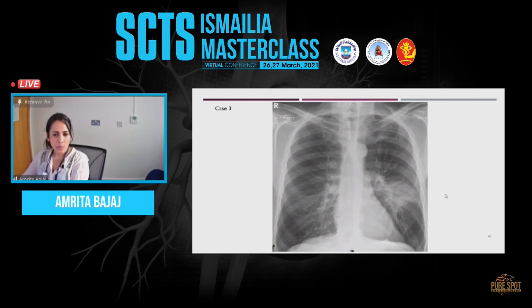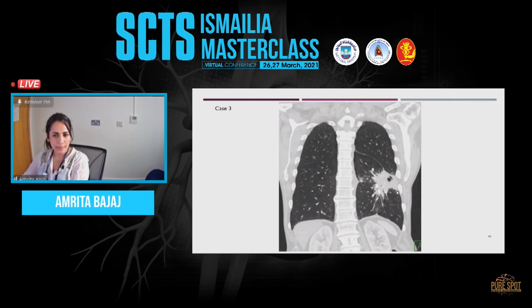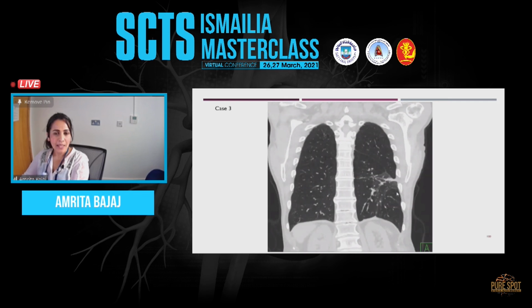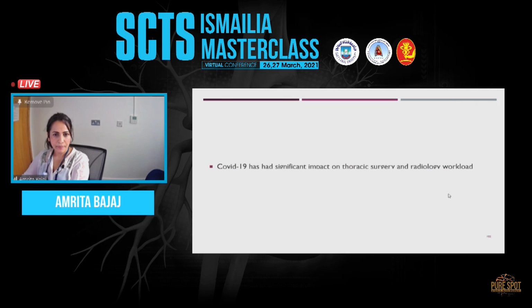A third case, where you can see a large mass on CT. It's large, it's cavitating, it's spiculated, all the signs, and it was PET avid. On a subsequent pre-operative CT, and we have a guideline here where anything outside a 6-week window prior to surgery, you repeat the CT, it was found to have disappeared. Same case, pre and then just prior to surgery.